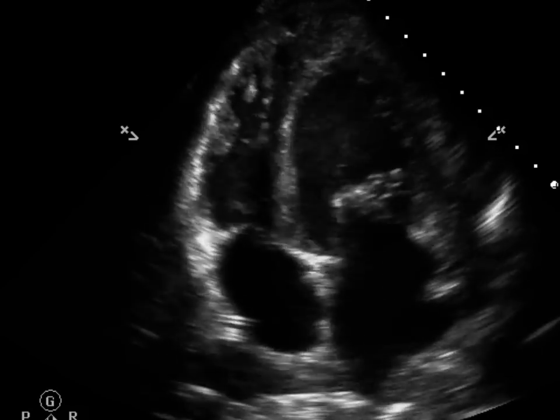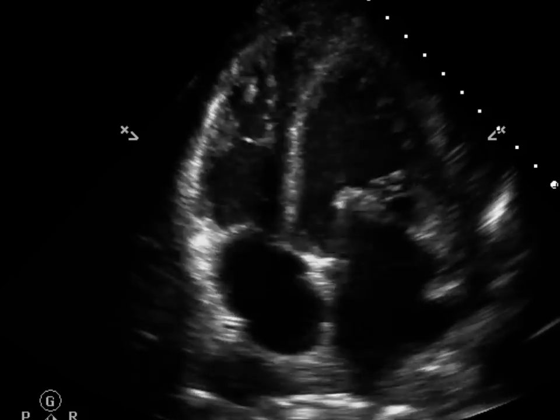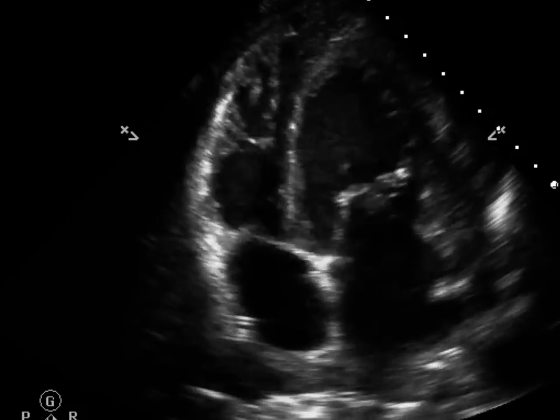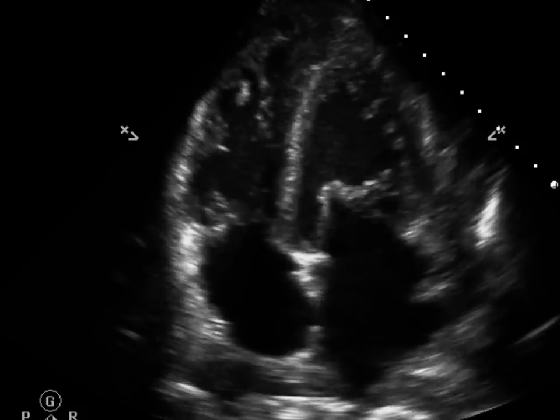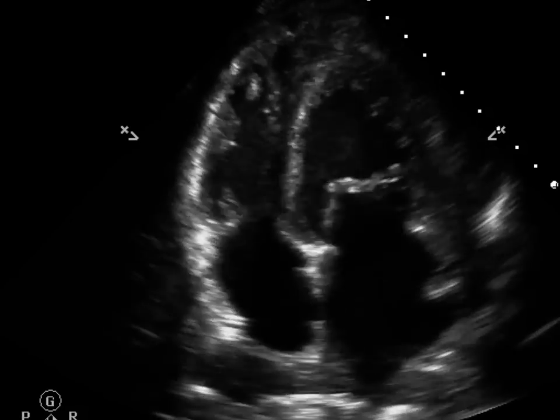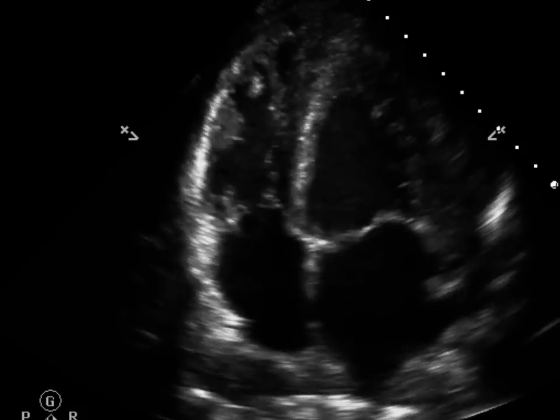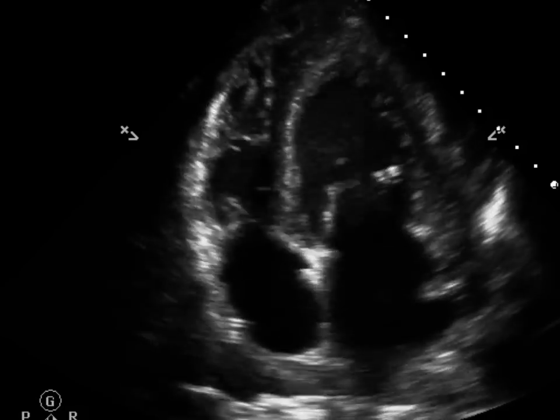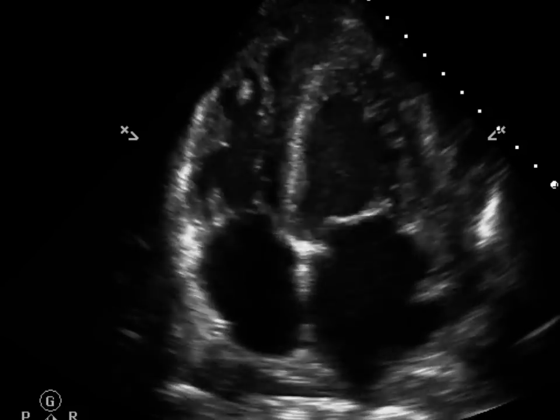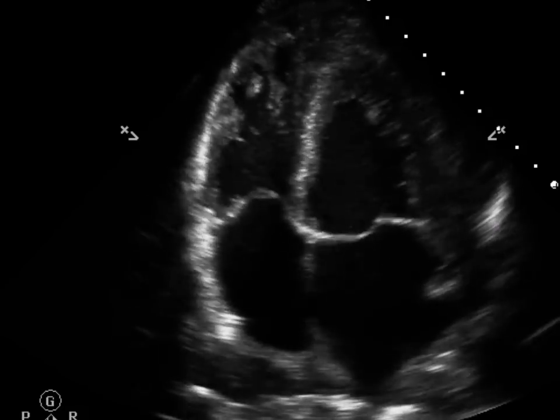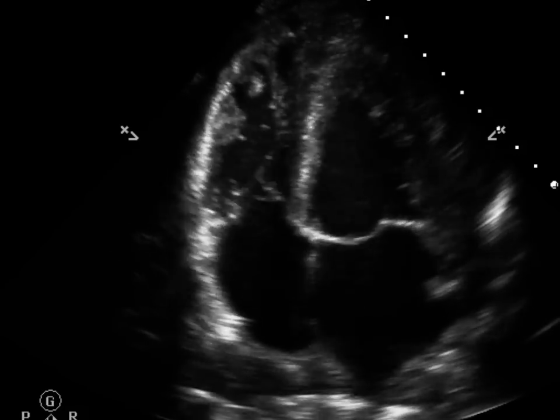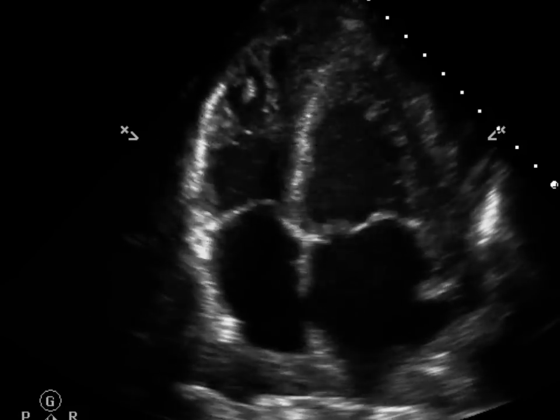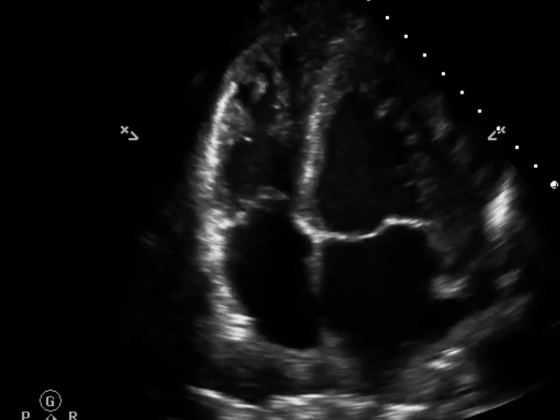Here's an apical four chamber example. You can see the top LAD territory, the septum, and the apex all seem to be moving really well. I'd say there's a little bit of dyskinesis on the lateral wall, which correlates with the circumflex.